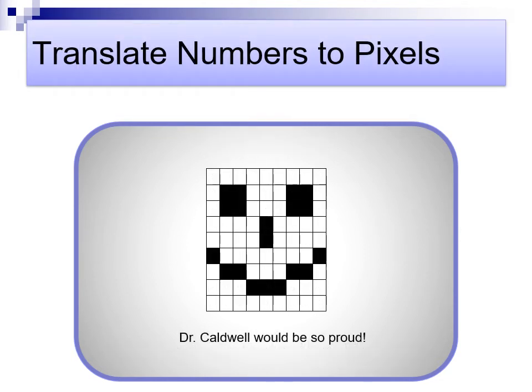Screen memory doesn't display numbers, it displays shades of gray. In the case of our computer, as pixels that are either black or white. Now, what is visible is a PA skull image. Not much contrast resolution because of the low number of memory locations devoted to each pixel.